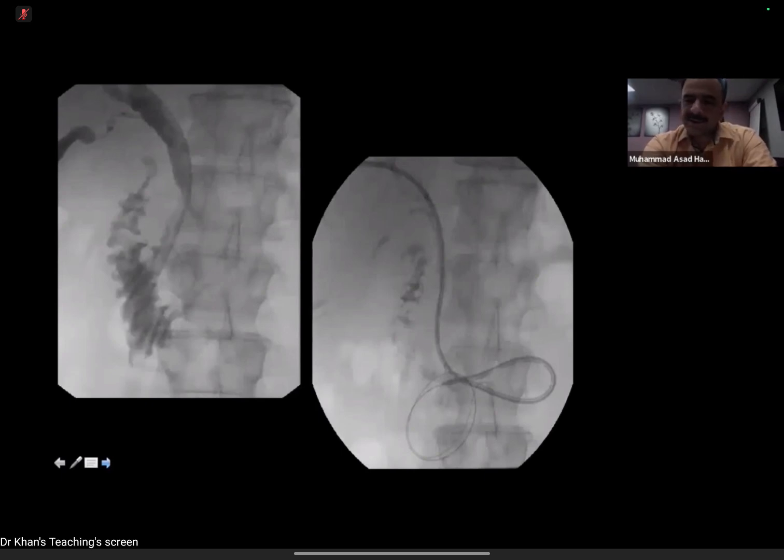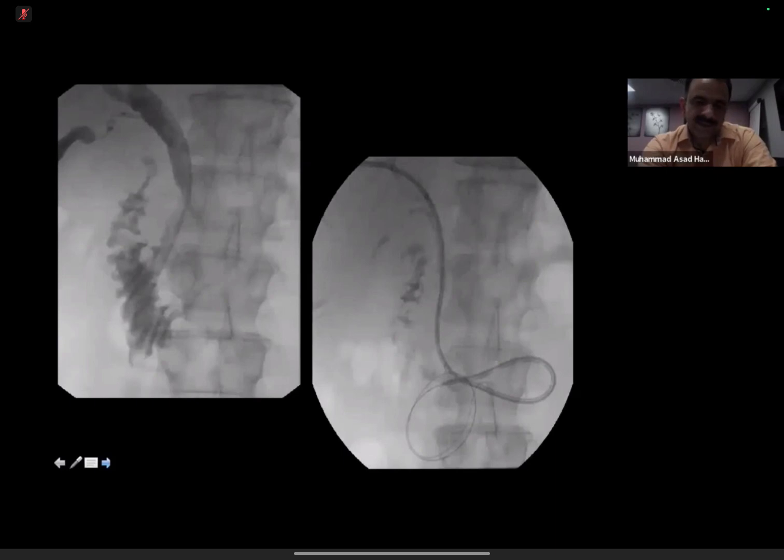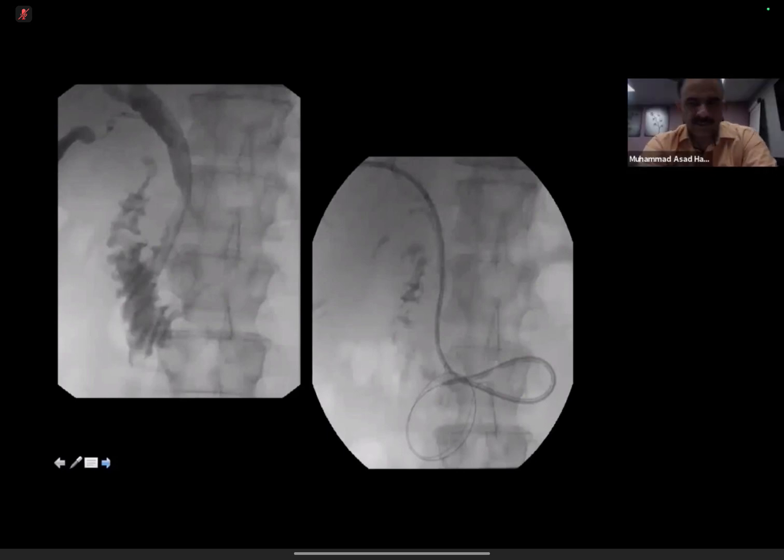Do you know how brush cytology is done? Haven't seen one. Well, in ERCP, they normally perform the brush cytology. It is a very small brush which is passed into the common bile duct, which is scraped at the site of constriction or at the site of stenosis or occlusion. Once it has been scraped and retrieved, the whole brush is cut off and sent for the cytology. Similarly, instead of going through the ERCP, you can use the PTC as well for the brush cytology.